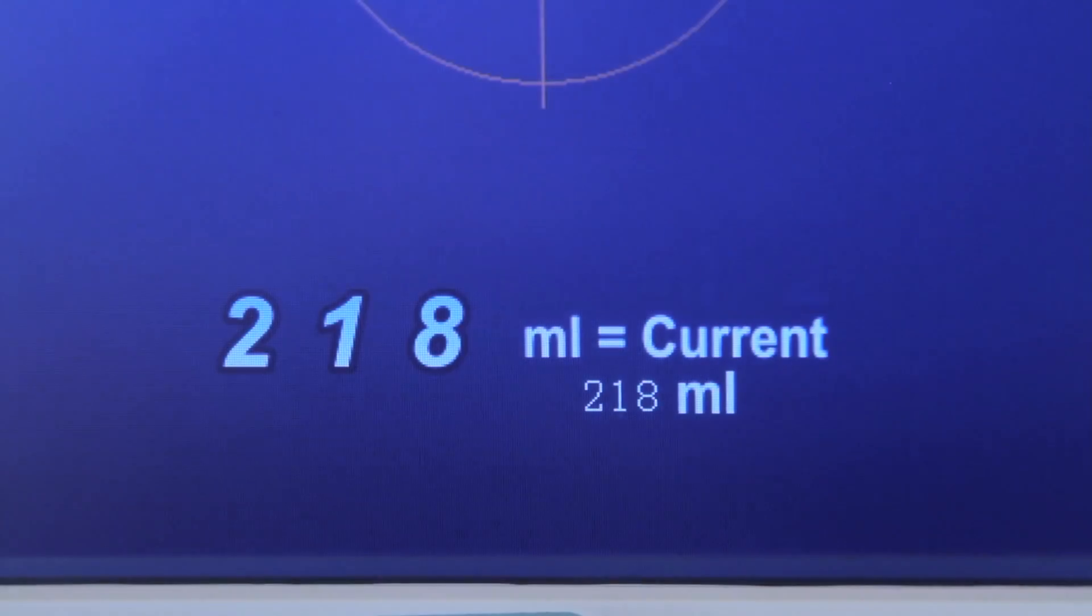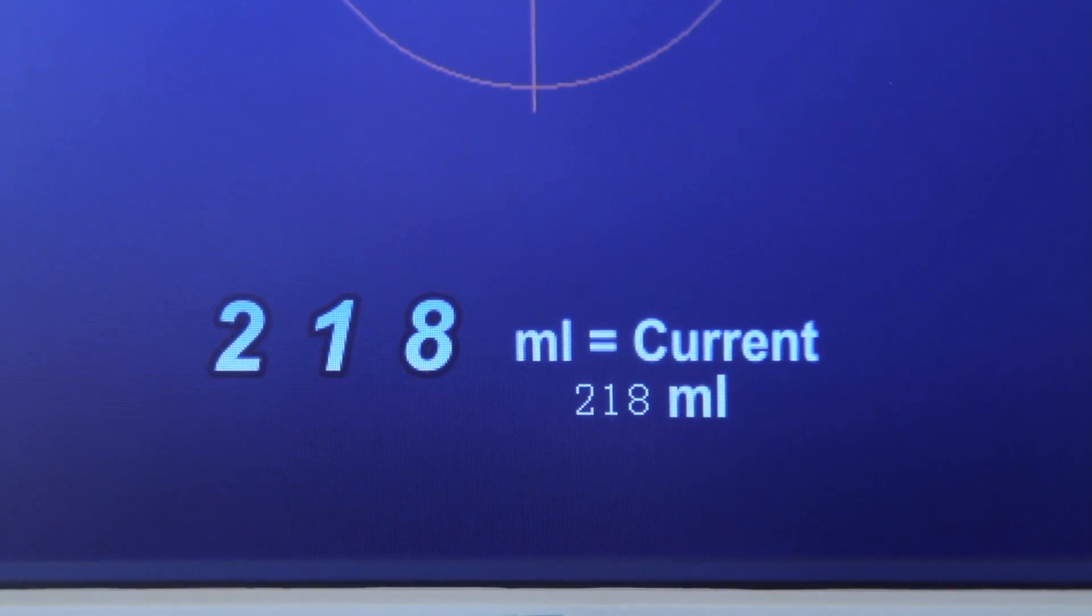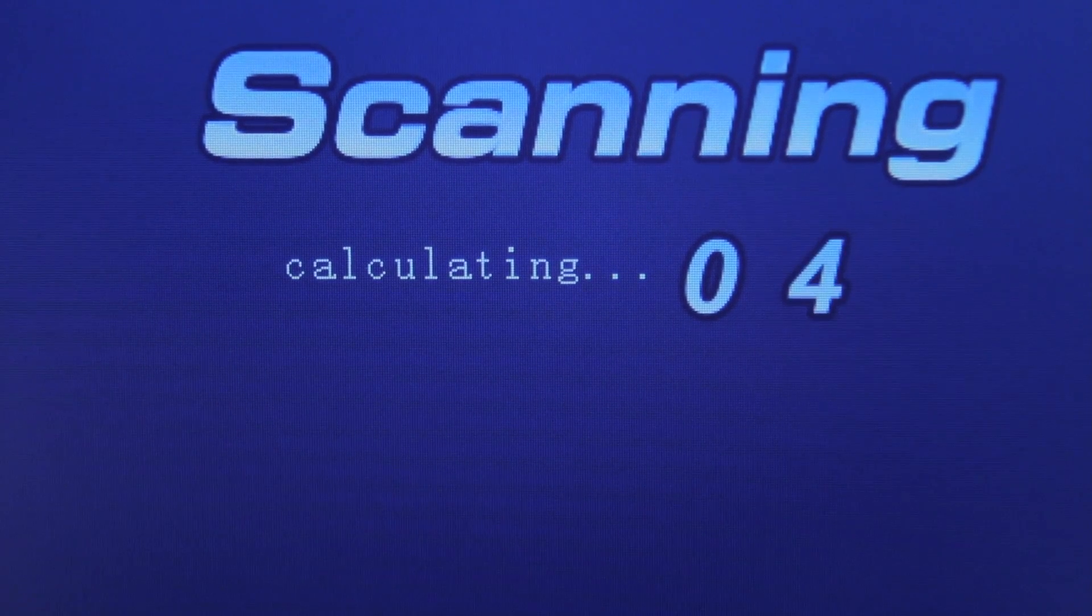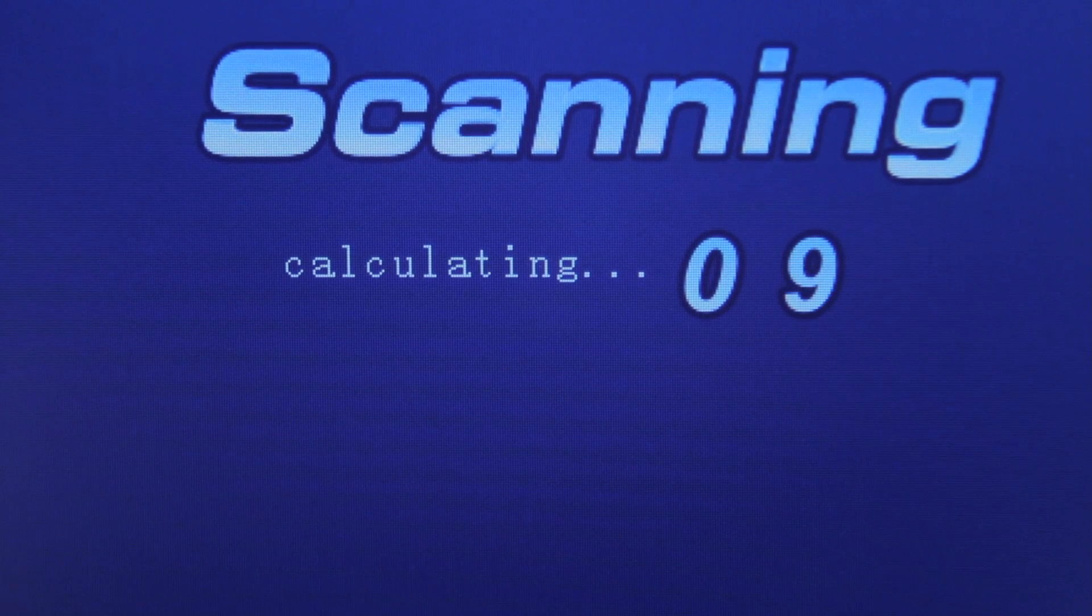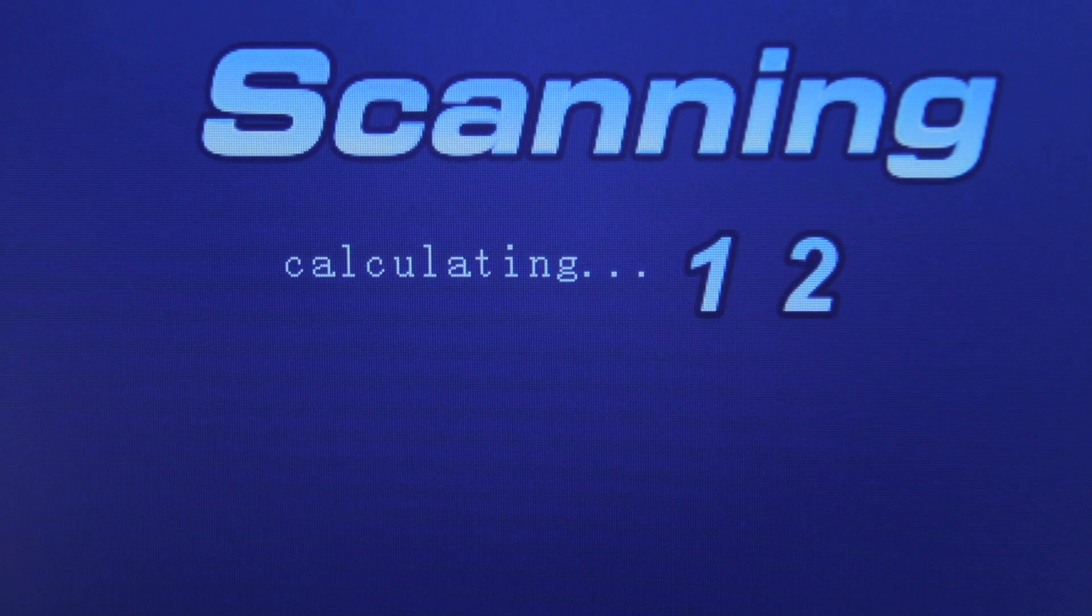The scanning progress will be displayed during the course of a scan. 1 slash 12 means it is scanning the first of 12 images. It will then enter calculating screen after the scan is complete. Calculating 12 means it is scanning the 12th image.